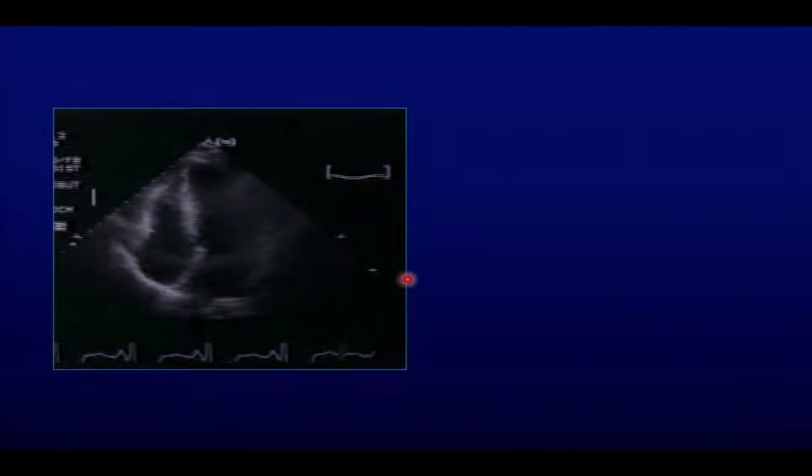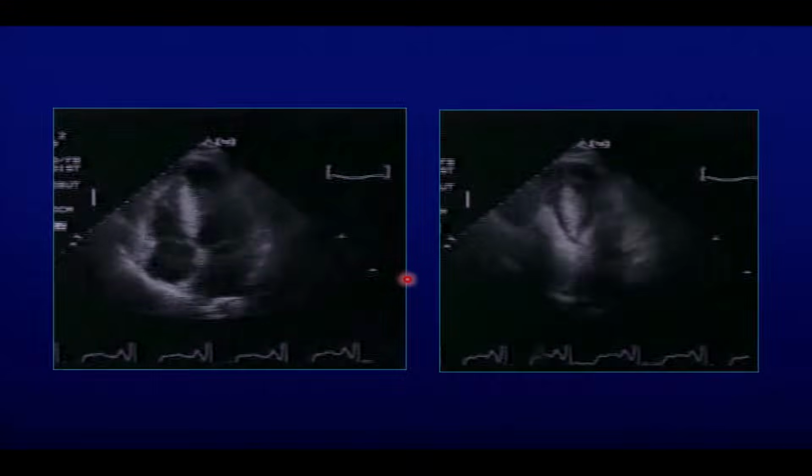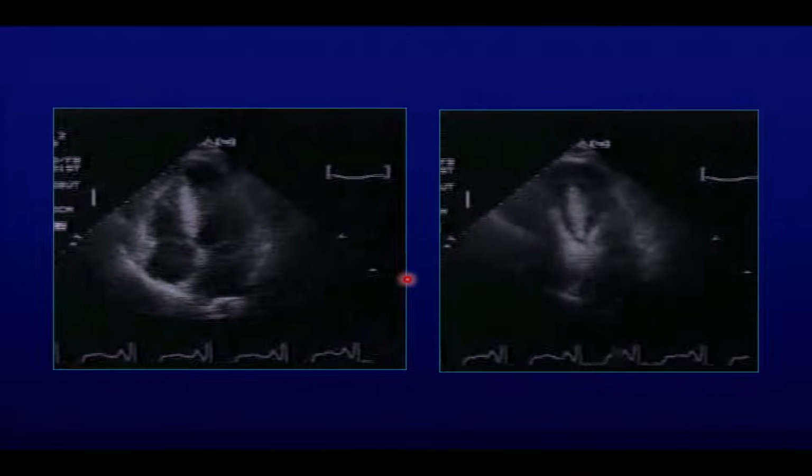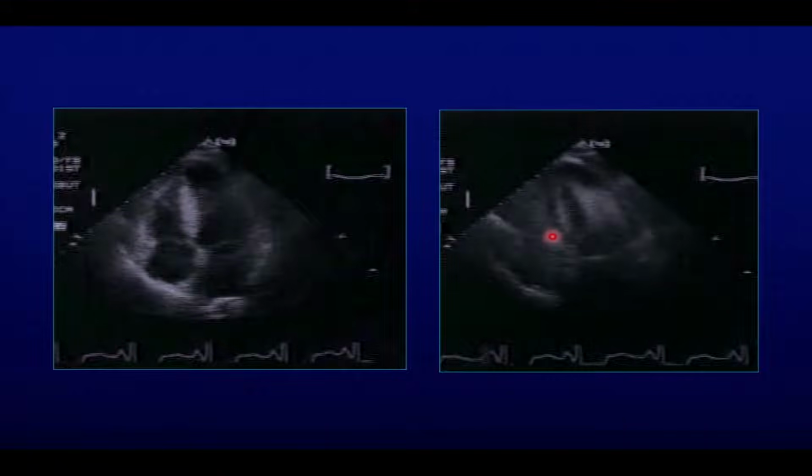Interesting kind of situation here. I can tell that ventricular function is good. I cannot tell how much is inside, right? Really can't tell more than this, and you need to know. And what I know here is I have an individual with a very thick septum.